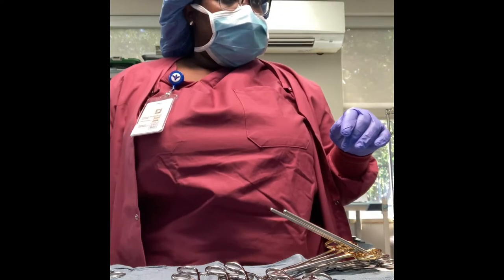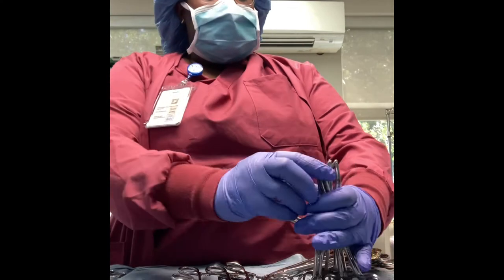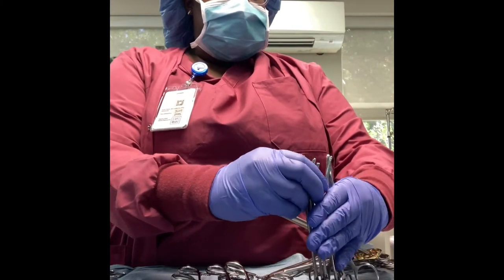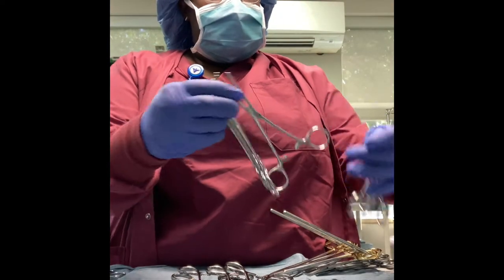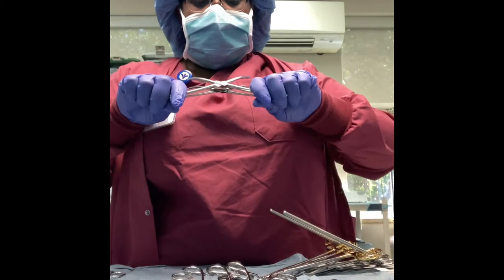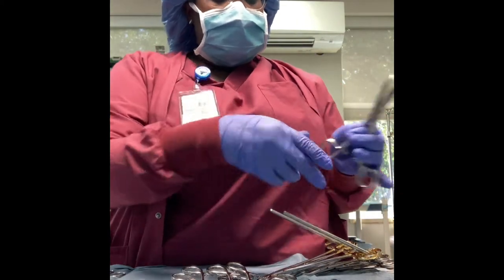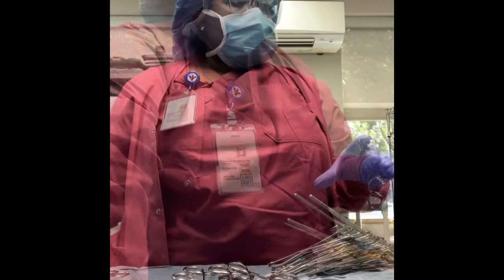You always want to double check your scissors — you don't want a doctor to go use scissors during surgery and they don't work. Now I'm finishing up on the stringer.